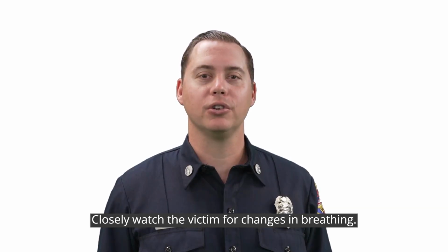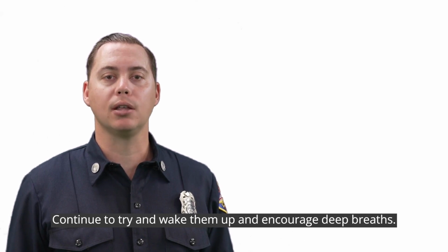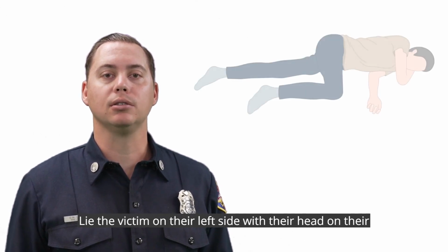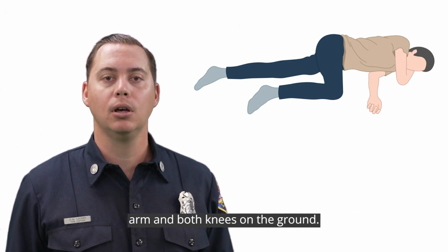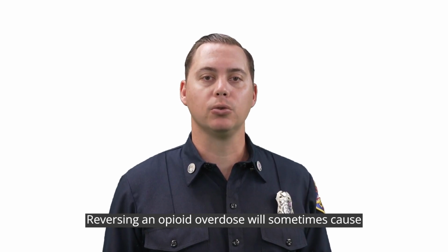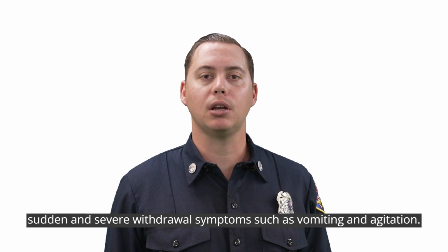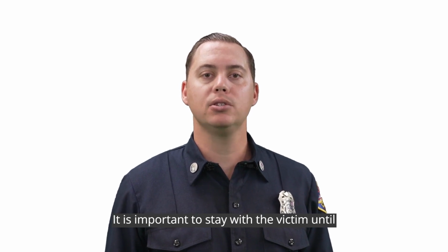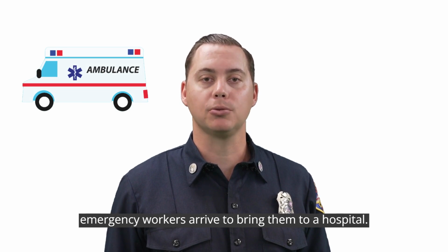Closely watch the victim for changes in breathing. Continue to try and wake them up and encourage deep breaths. Lie the victim on their left side with their head on their arm and both knees on the ground. This will help prevent choking. Reversing an opioid overdose will sometimes cause sudden and severe withdrawal symptoms, such as vomiting and agitation. It is important to stay with the victim until emergency workers arrive to bring them to a hospital.